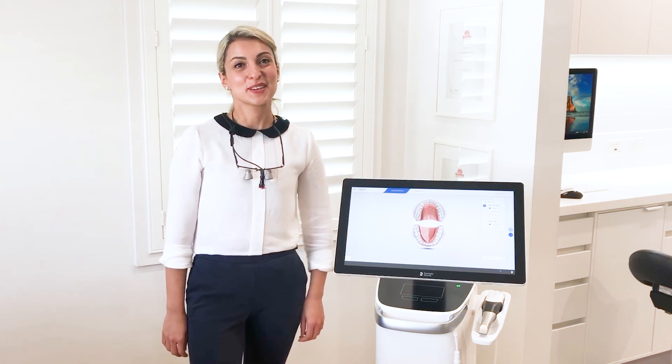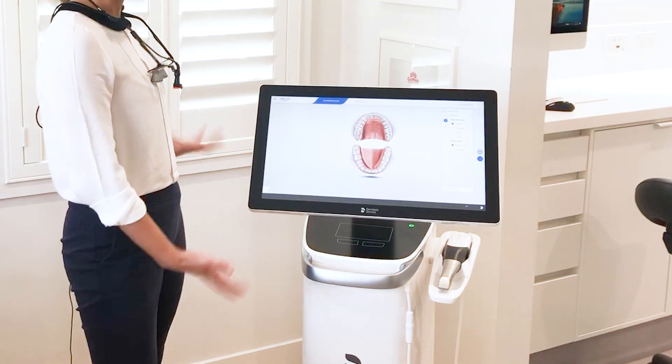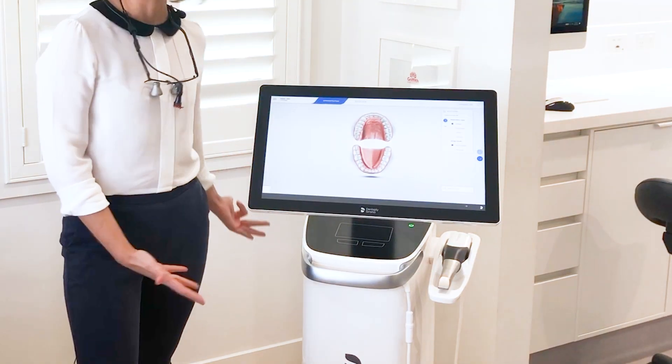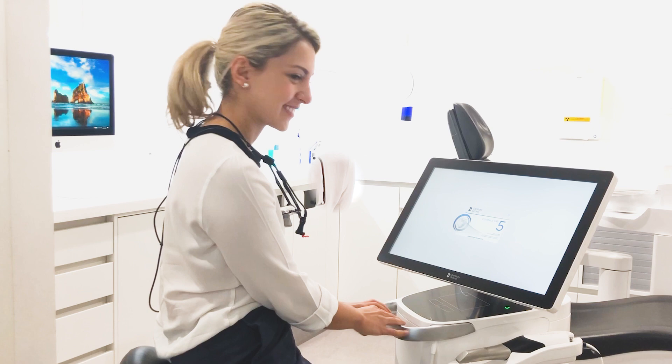Today I'm going to talk to you about how you make a good first impression at HelloSmiles. I'm actually going to talk to you about our really cool new piece of technology we have from Dentsplash Serona. This is a PrimeScan and this is our new way of taking impressions in a 3D digital way. It's literally the first of its kind in Australia and we're very lucky to have one. What it does is it takes an impression of your mouth through a 3D scanner.